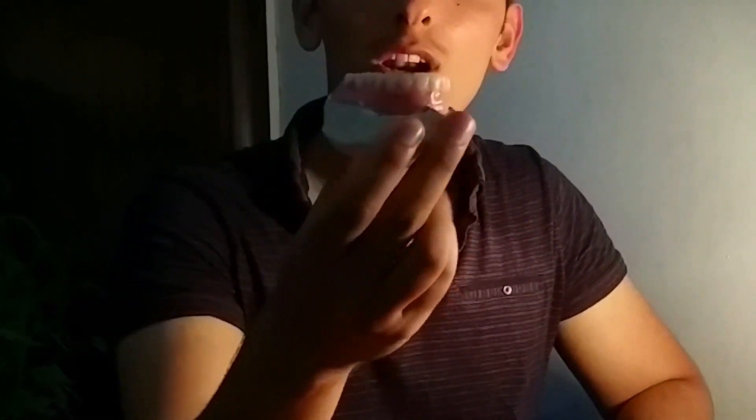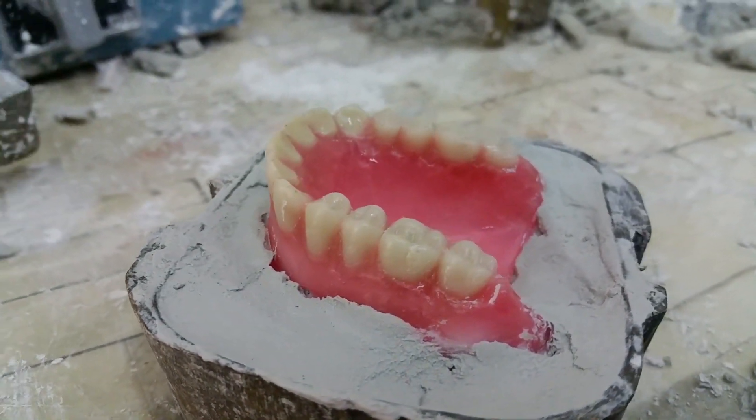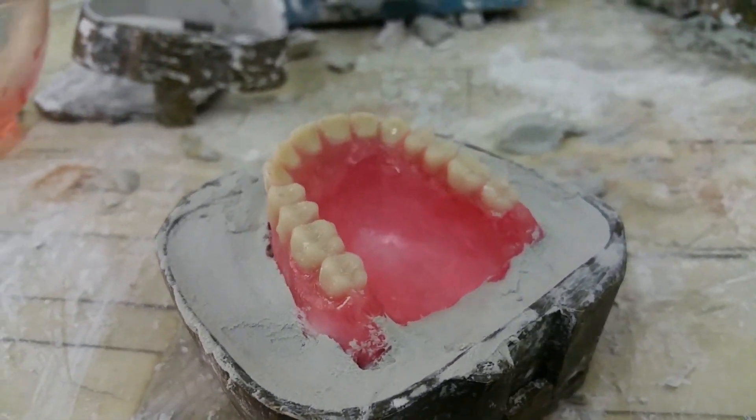We take the part that we want to flask — for example, the maxillary part. We take our now-separated maxillary model and place it into the lower part of the flask, which should already have been filled with gypsum. The model is pushed into the flask until only the wax part remains above the gypsum.